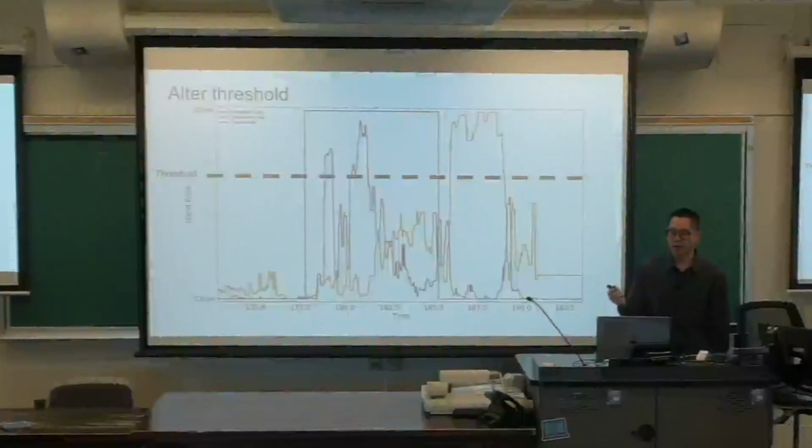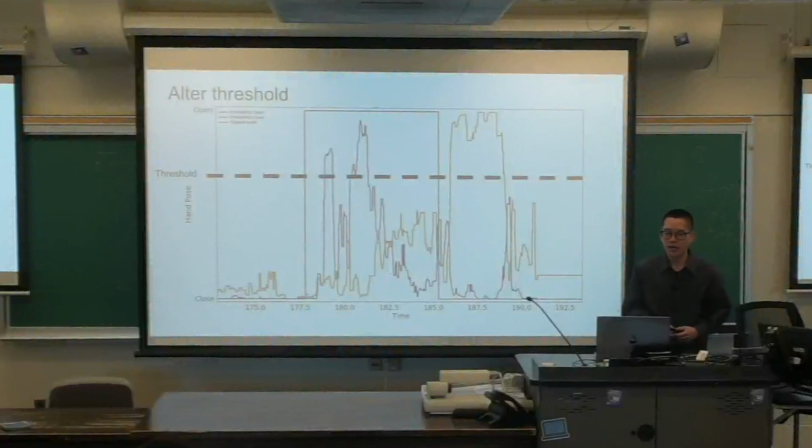For example, if you have a predefined threshold of 0.8, and at a certain time step you are predicting 0.6 as open, 0.4 as closed, even though the prediction is open, you don't send a command. You only send a command if your open probability is over the predefined threshold. In this case, it's not over the threshold, so you remain in the previous state. You don't change the state.